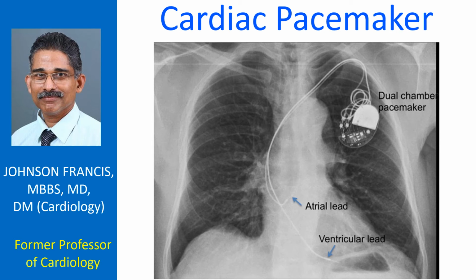The pacemaker lead is a passive component which transmits the pulse to the heart and receives the heart's electrical signals for the pacemaker to analyze. The current day demand pacemakers will sense the heart's intrinsic activity and give pulses only when they are not present. There are pacemakers available which can pace 1, 2 or 3 chambers of the heart. They are known as single chamber, dual chamber and biventricular pacemakers respectively. The biventricular pacemakers are mainly used for synchronizing the contraction of the two ventricles in patients with heart failure.